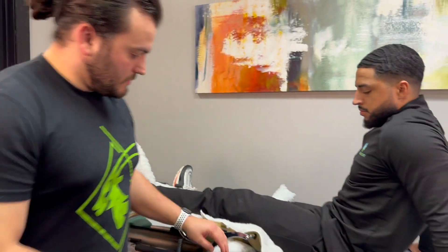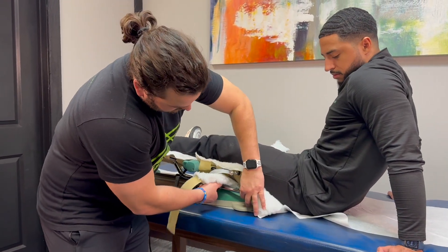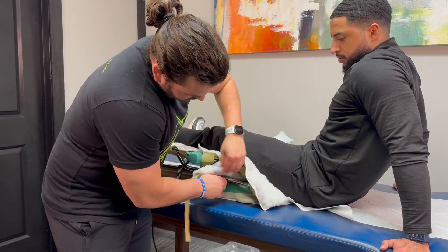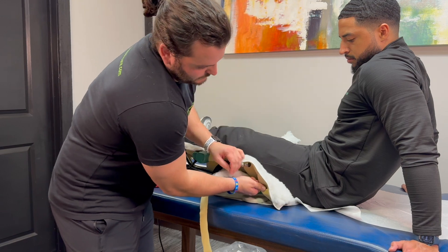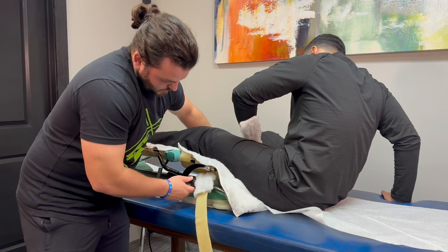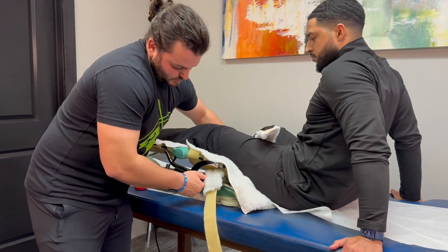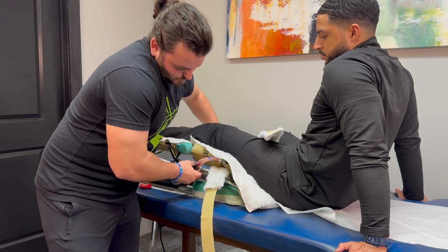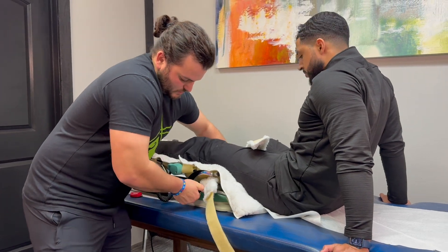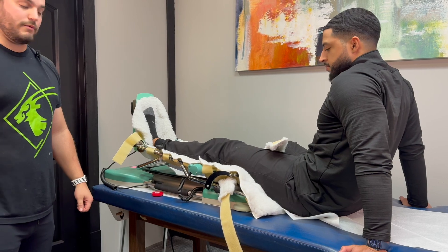There are also other knobs for patients that are perhaps too short or a little tall to get them into the CPM more comfortably. If the patient is taller, you can extend it more on both sides. This helps with shortening or lengthening the CPM to the patient's leg length. Those are all the adjustments you have for a CPM.